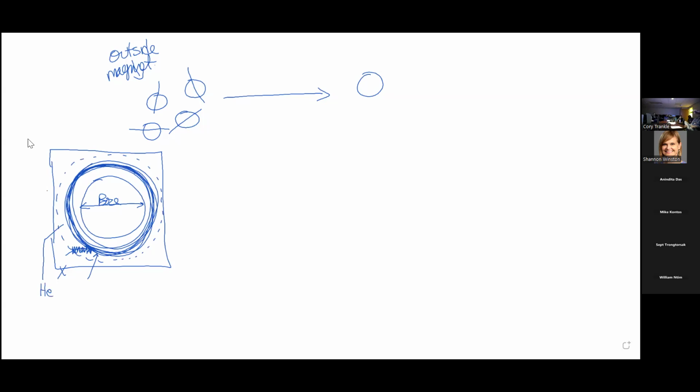Now, it's not the helium like when you were younger and going to the birthday party and everybody undoes the helium balloons. It's not in the gaseous form. It's in a liquid form. And what that does is it super cools the wire to 0 degrees Kelvin. And at 0 degrees Kelvin in that wire, there's no resistance to electricity, the electrons moving around. So it's kind of interesting.